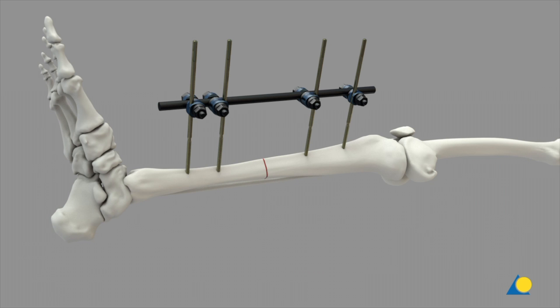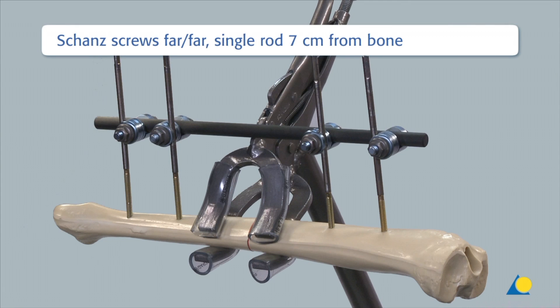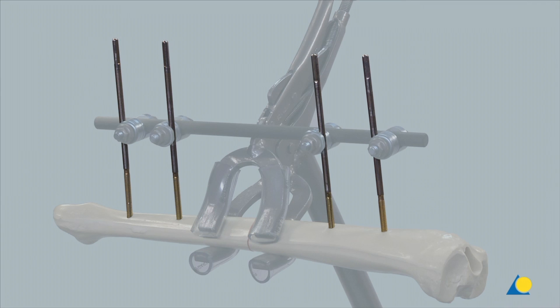The position of the frame should not interfere with access to the wound for the initial debridement. In this single rod construction, the Schanz screws are placed in the far-far position. The rod is placed 7 cm from the bone and secured with four large open self-holding clamps.